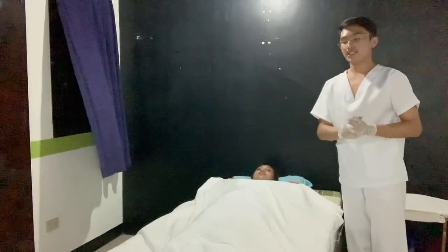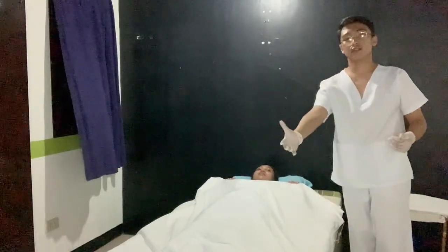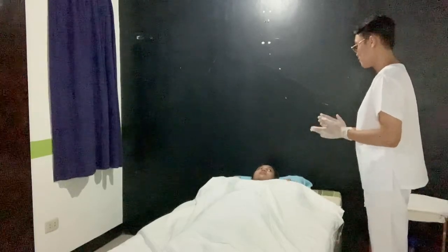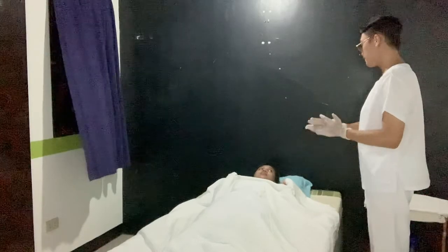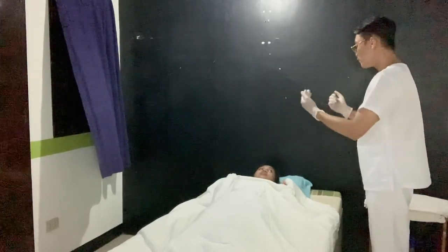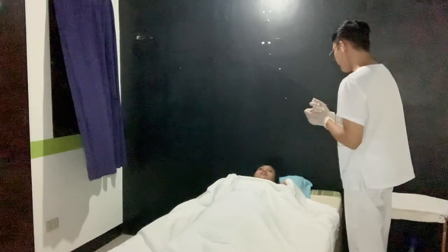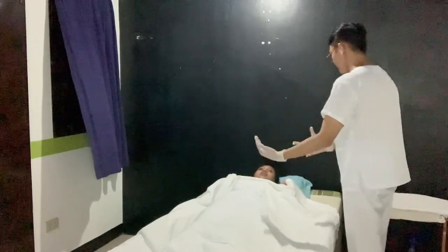Now, position the patient by using the three segments: the upper, the middle, and the lower section of the body. Ma'am, I will now position you onto my side by using the three segments. And as a permission, can I move your head, your body, and your feet? Yes. Okay. So on my count of 1 to 3, move your head, your body, and your feet, okay?